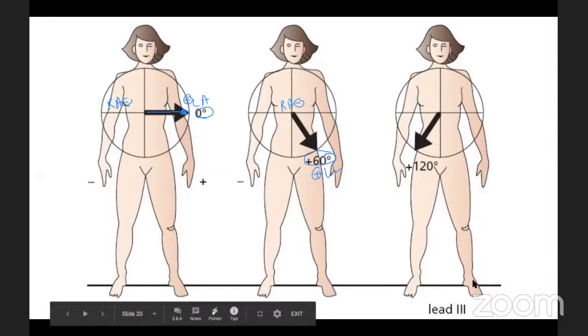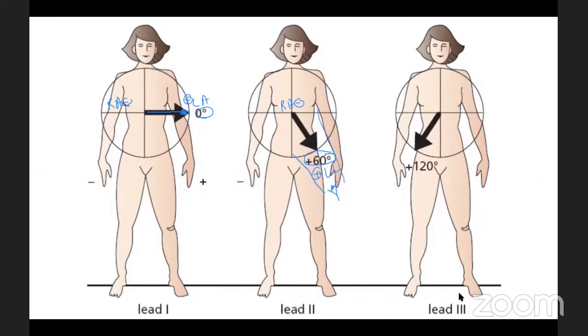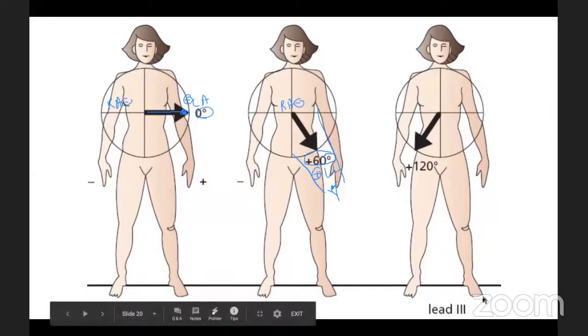Oh yeah, and for this, we were talking about the elephant, looking at the elephant from different angles. So what's the angle we're looking at? Here, let's pretend this is an eye. So your eye, or basically the electrode, is looking at the heart from here. So it's looking at it from almost the inferior angle, but at an angle. So see how specific it is. It'll give you the most specific, accurate readings on an ECG, because it's looking at the heart from a 60-degree angle. Over here, it's looking at the heart from a 0-degree angle.